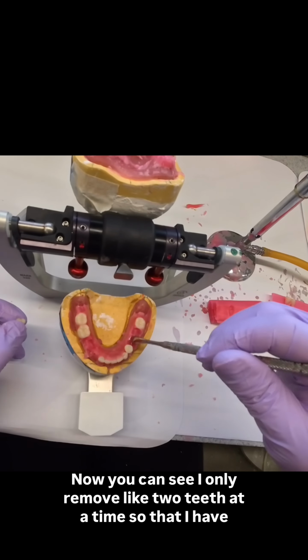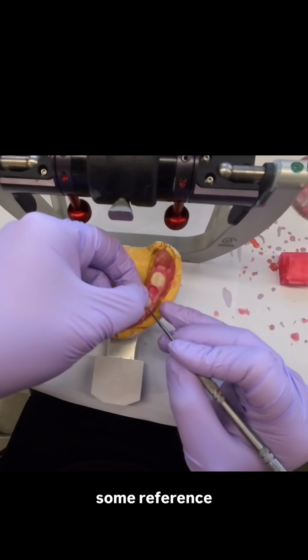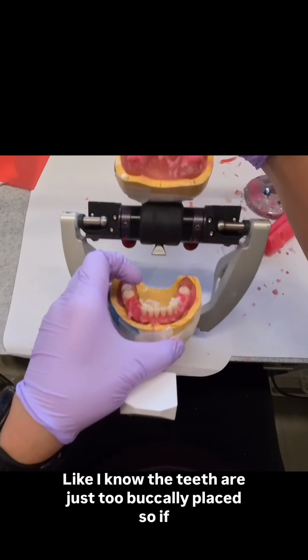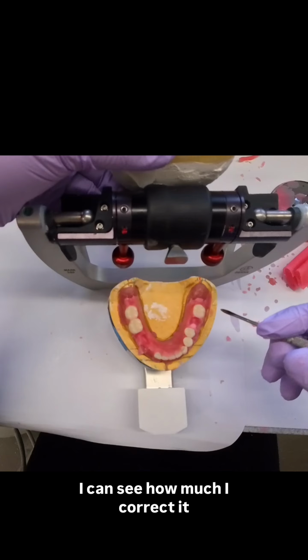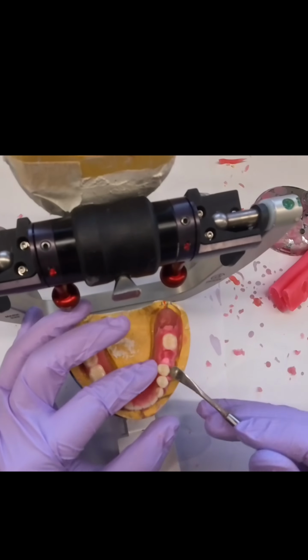Now, like you can see, I only remove like 2 teeth at a time so that I have some reference. I know the teeth are just too buccally placed. So if I keep some of the existing setup there, I can see how much I corrected. Okay, that's why I left it there.